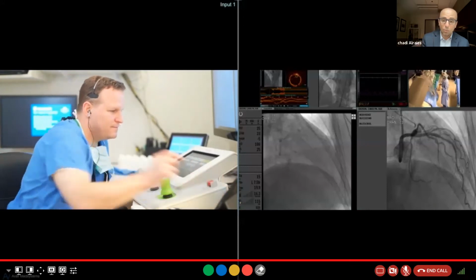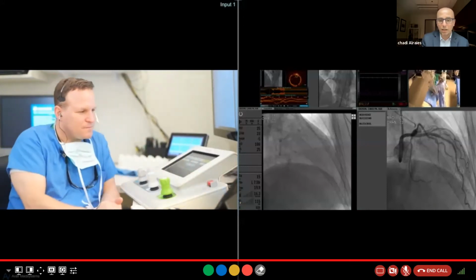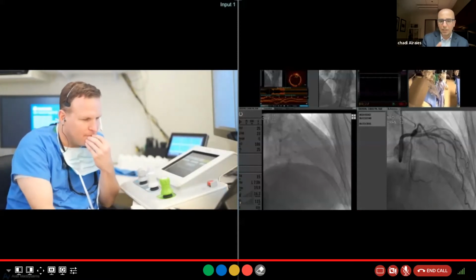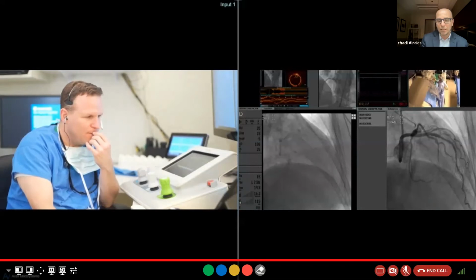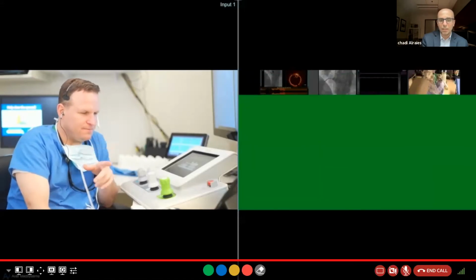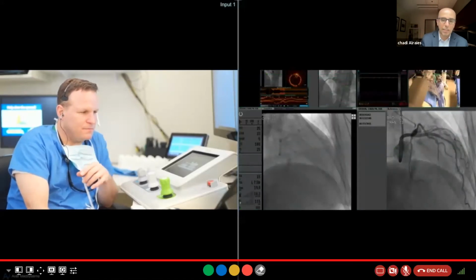And then one more point, how you illustrated the ostial flash. I think it's in the new balloon. We used it a few times, but it requires some preparation, which is very unique. But definitely it makes your stent, if any spots are bulging out from the ostium into the aorta, completely flush, to help you with future engagement.